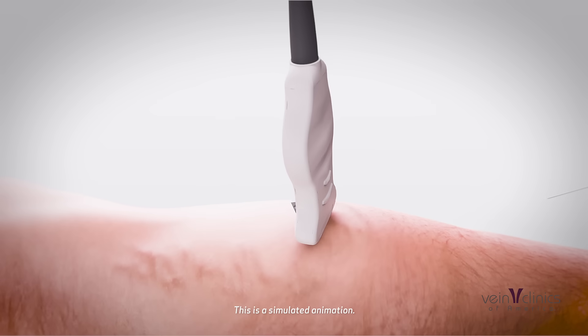A guide wire is inserted into the vein with unhealthy valves.